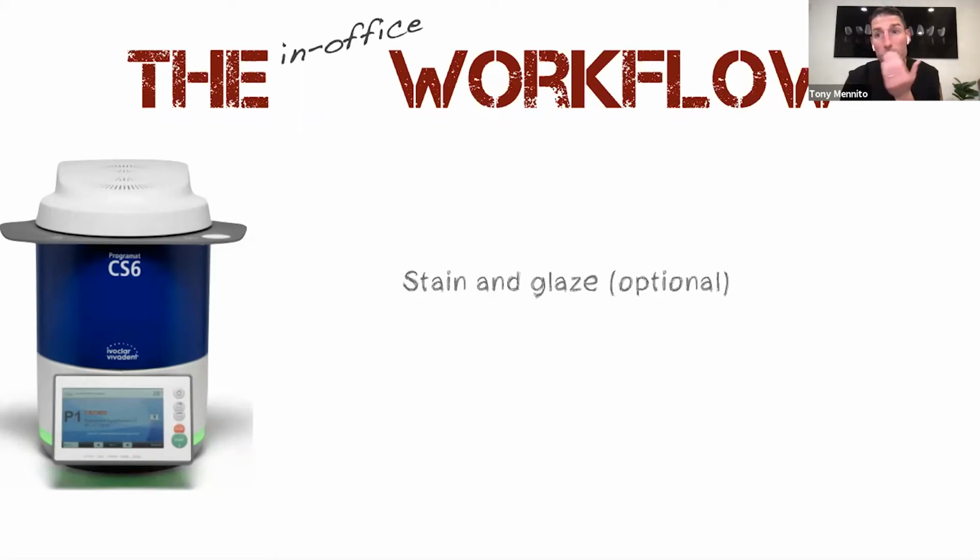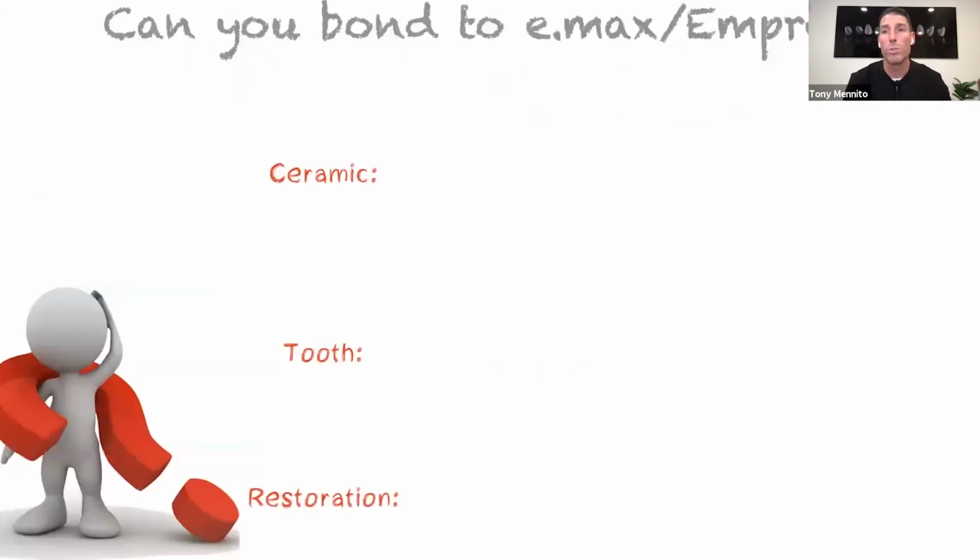You may not have to for multiple units where you're controlling the smile yourself, but that cycle takes about 20 minutes. So it is a little bit of a commitment, but with the result that you get, your patients aren't going to mind sitting in the chair a few extra minutes, because this is a truly, truly beautiful restoration.